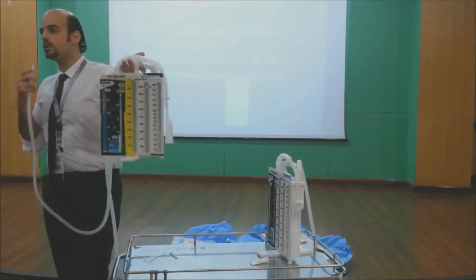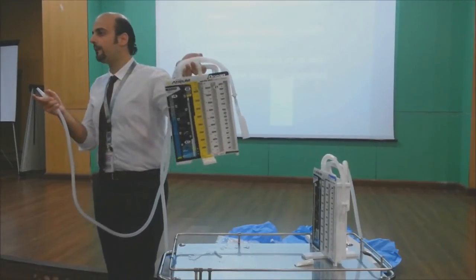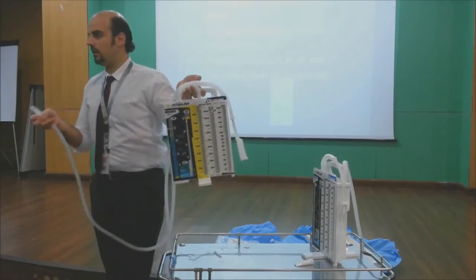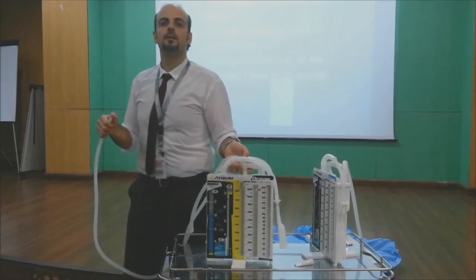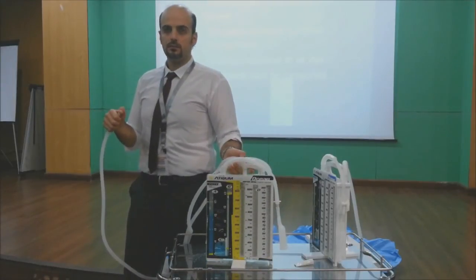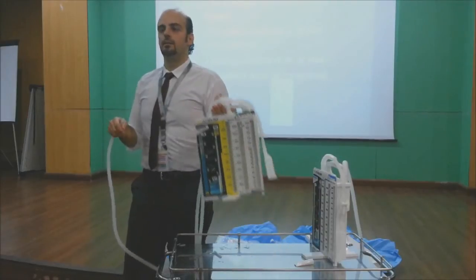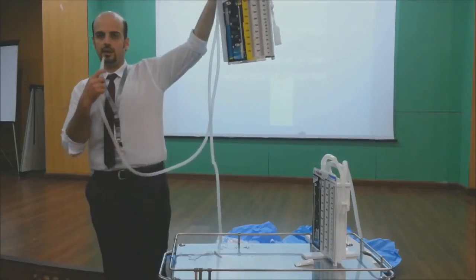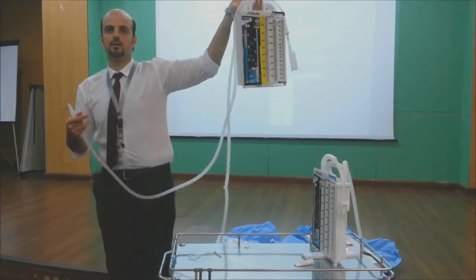So, what's the name of this? Oscillation or tidalization or fluctuation or anything. If you take this tube down and you take the chest tube 1 meter up, is there any chance for the fluid to come down? Yeah, it will come down. So how come it's one way? Yeah, because the water is heavy. If I put it 1 meter up and I pull, sorry, the water will come out to me.